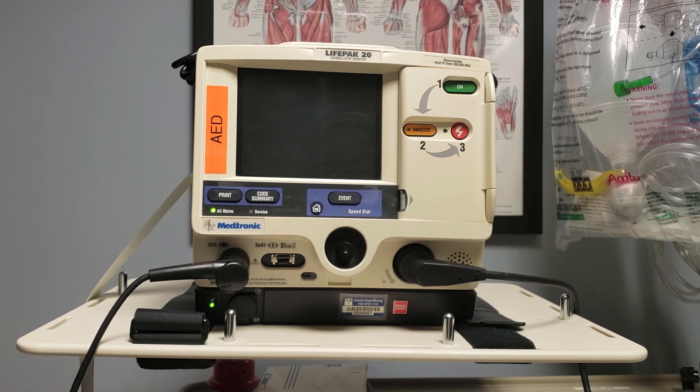Hi, this is Ken, and I'd like to take a moment to review using the LifePak 20 to defibrillate a patient.